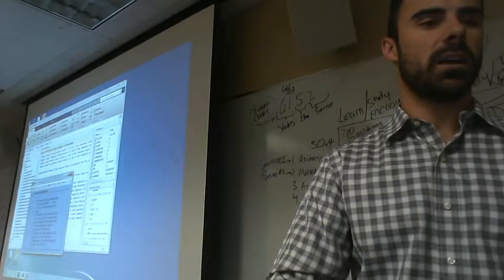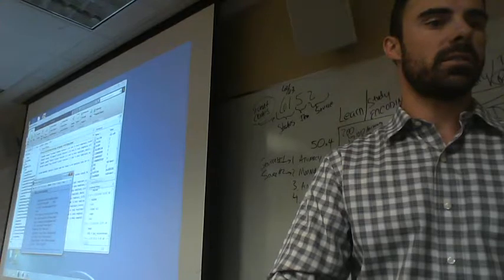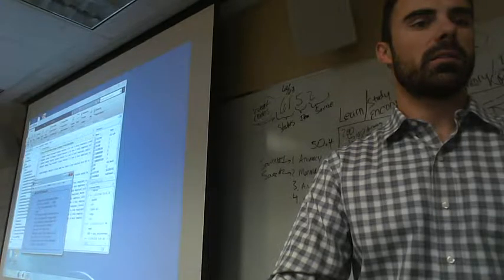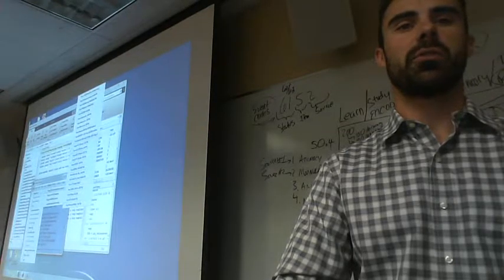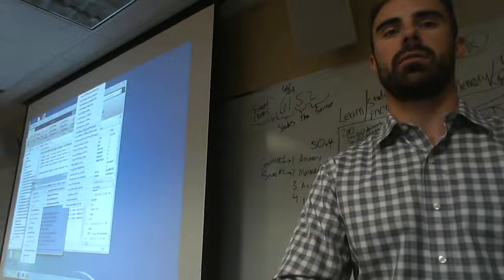And what I'm going to do is, let's go to File, Import Data. We will do our plugins up here, and we can do from Biosemi BDF file.